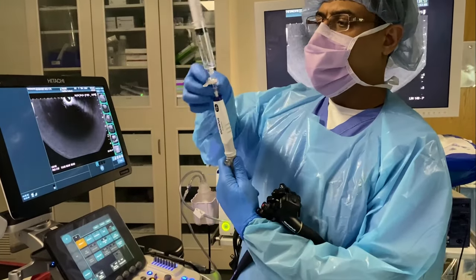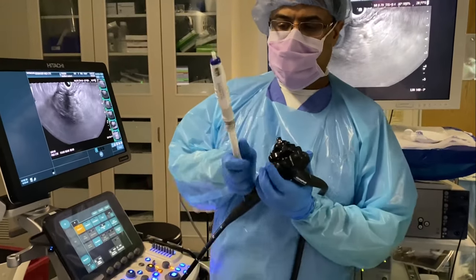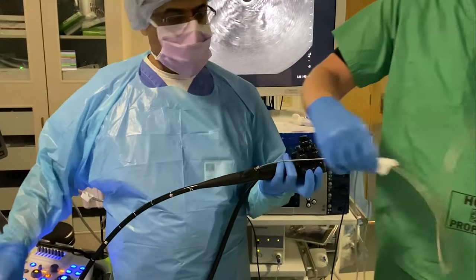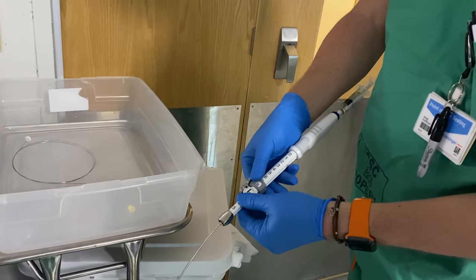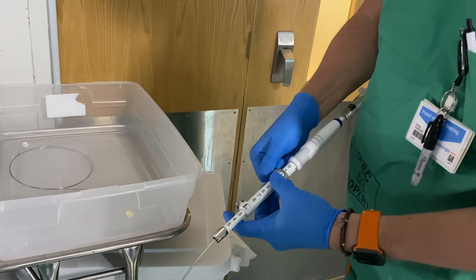Once the puncture is completed, the suction syringe is removed from the top of the needle and the needle is withdrawn from the echo endoscope. For EUS guided liver biopsy, the specimen prep is performed on site.